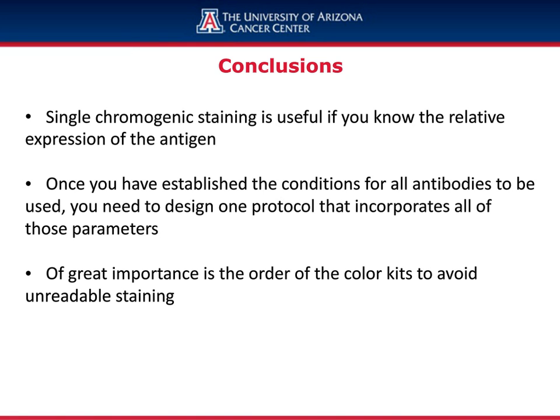Of great importance, and I can't stress this enough, you need to pick out your proper colors and put them in an order that is going to give you a readable color.